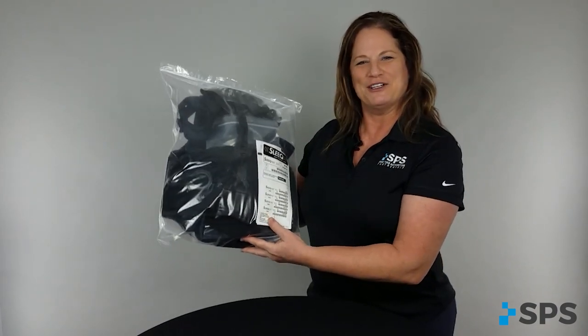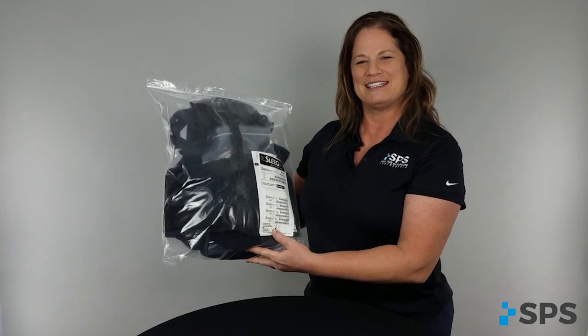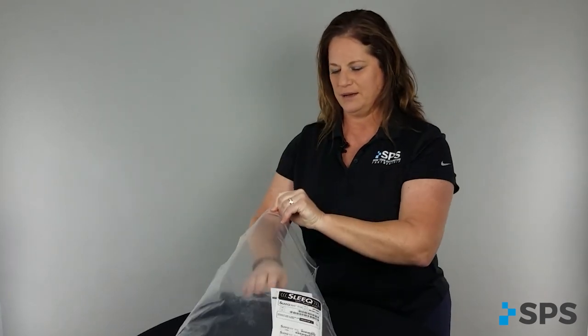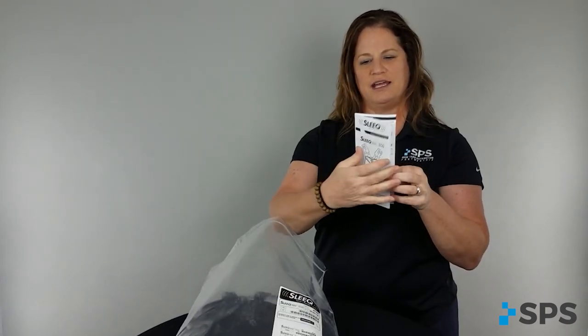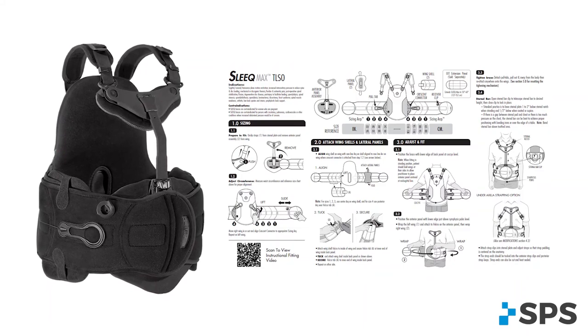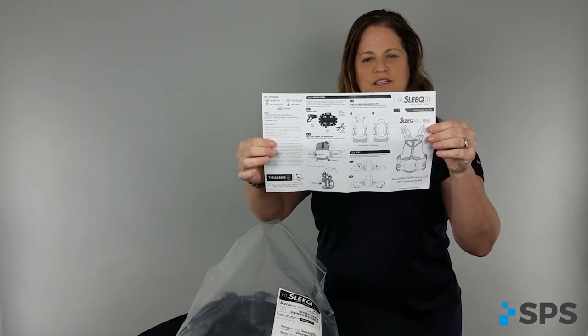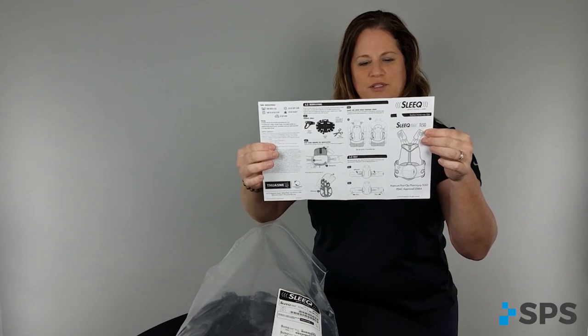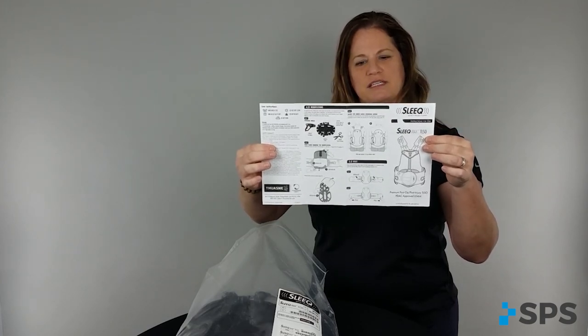When you receive your Townsend Thuasne SLEEQ Max TLSO, the product number is here. You're going to open it up. There's a very important instruction guide covering how to make adjustments and how to measure the patient. On the back side, there are additional instructions on how to adapt the lateral, anterior, and posterior panels to meet the patient's needs.